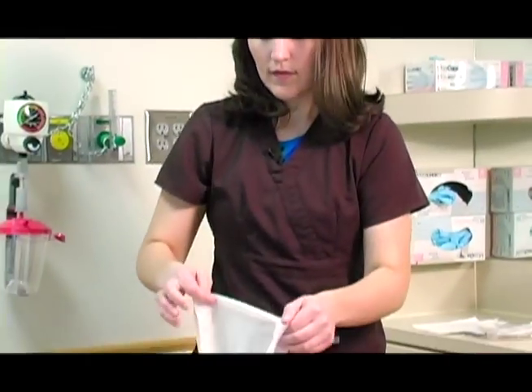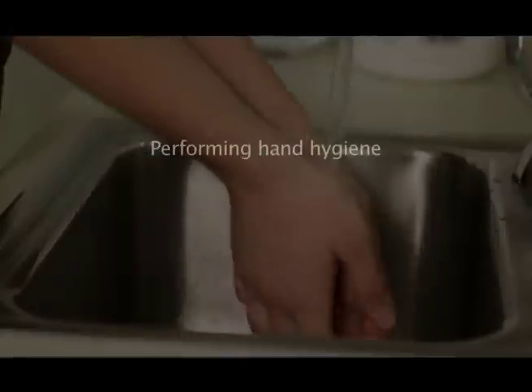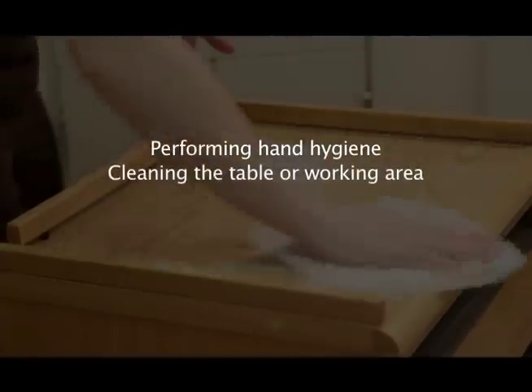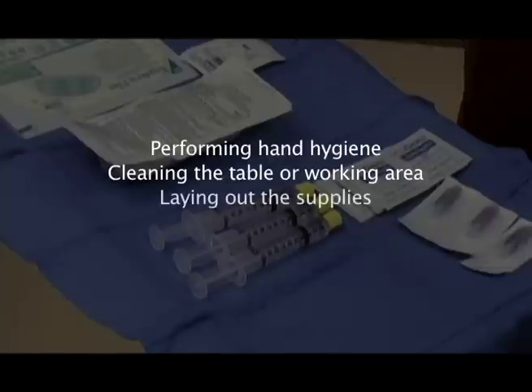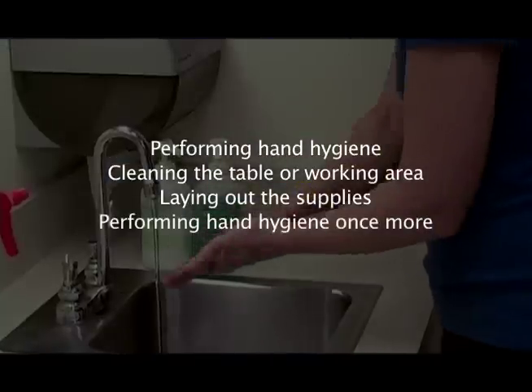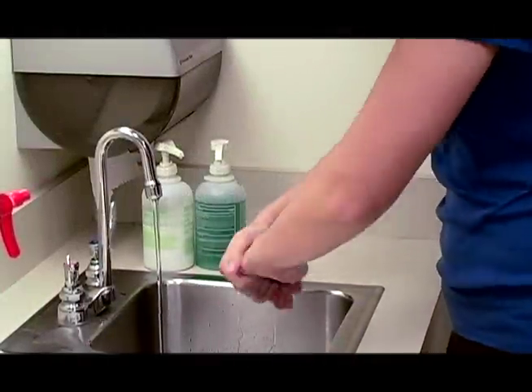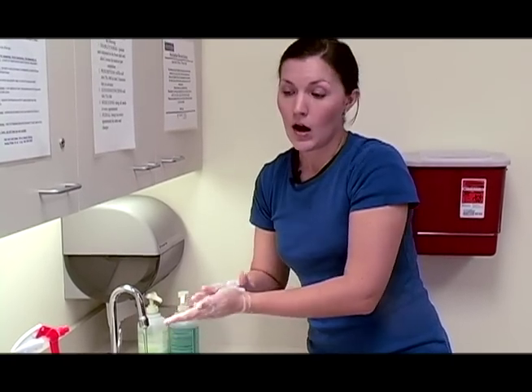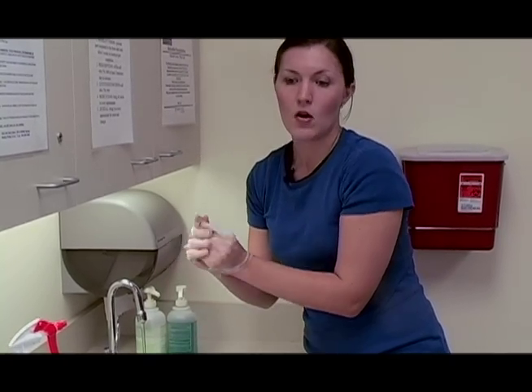The first step is preparation. This involves cleaning your hands or performing hand hygiene, cleaning the workstation you will be working on, laying out your supplies, and then cleaning your hands once more. If you have questions about cleaning your hands or preparing your workstation, refer to the section titled Changing the Dressing.